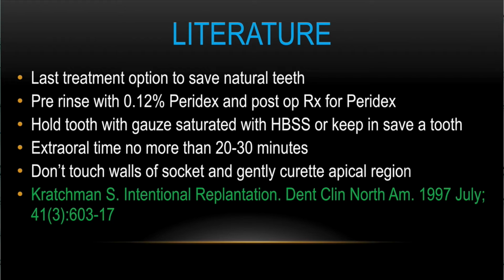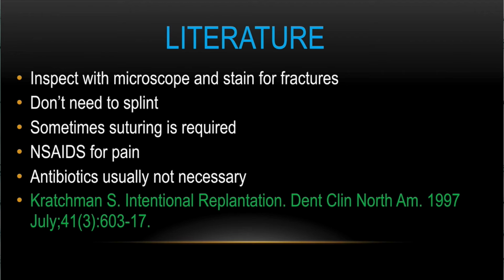And it's important during the procedure not to touch the walls of the socket. And if you have to curette, just go as far apical as possible if you want to sample for biopsy. As with endodontics, every tooth, every procedure, we're working under that microscope. We can inspect it, and we stain these teeth for the fractures, as you've seen in the intraoral photos we had taken.